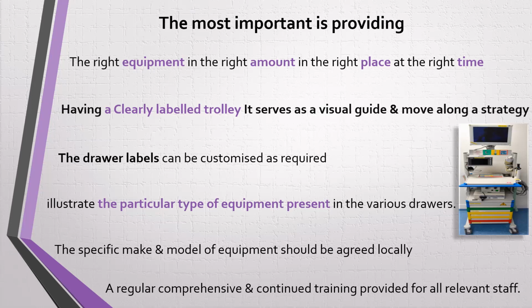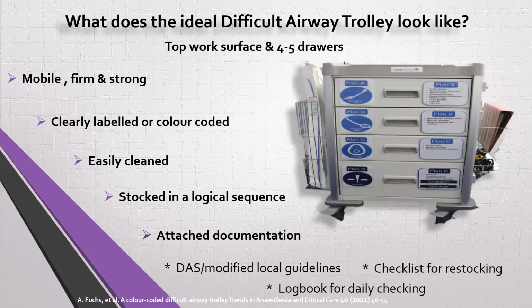It illustrates the particular type of equipment present in every drawer, and this specific make and model of equipment should be agreed locally. There should be a regular, comprehensive, and continued training provided for all relevant staff, anyone dealing with the airway.